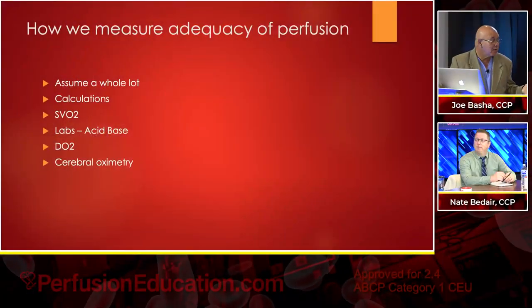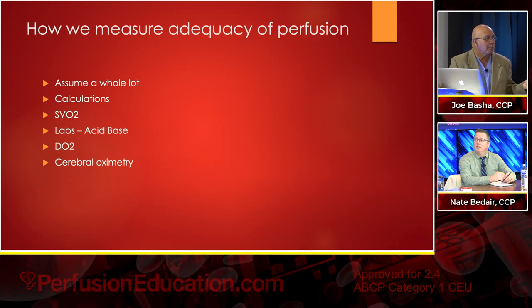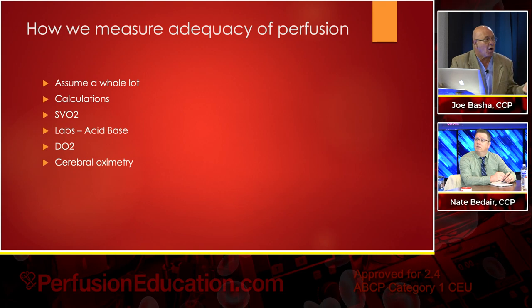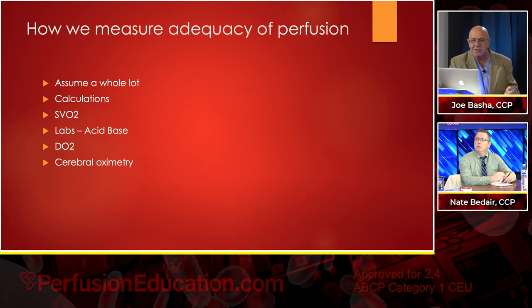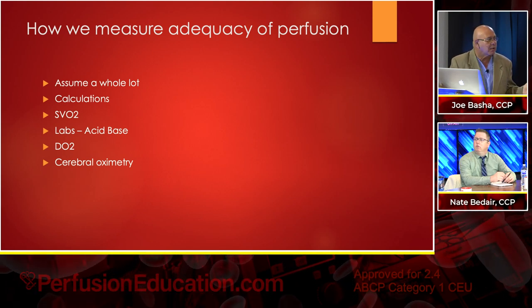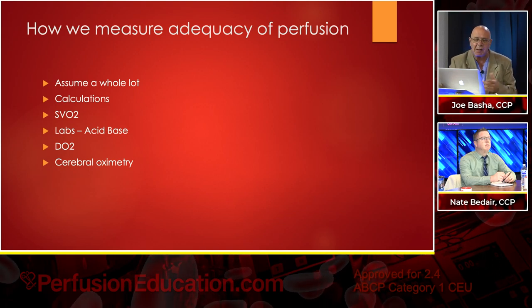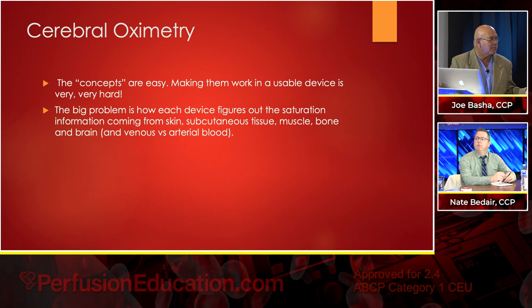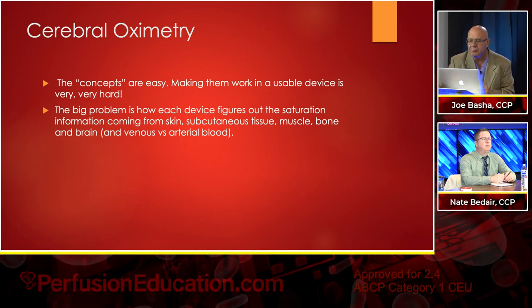It's why we should use it, the hypercare, but I think we should use it for the pump prime. I think we should look at bicarb-based solutions for all of our cases as a traditional prime, not sodium chloride, not Plasma-Lyte, not lactated Ringer's. It works, they're all good, but I think bicarb-based solutions are just the better solution to use. Problem is, they're just too expensive and they come in 5-liter bags. Nobody wants to package them in 1-liter bags because of cost.